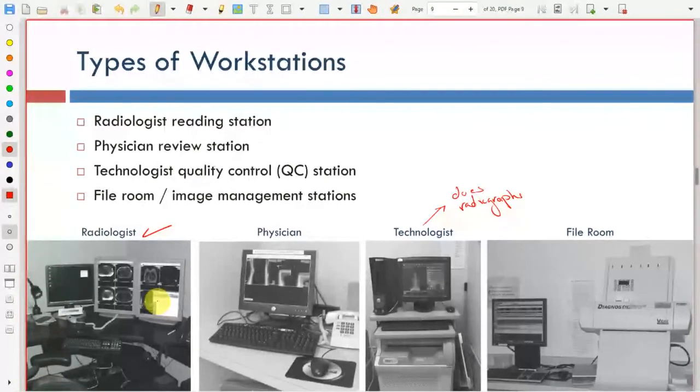Medical grade monitors are extremely high resolution, extremely high brightness. They are very expensive. The color reproduction there is really calibrated so that you don't have differences in colors between different times and different monitors. Basically, it's a much more controlled and much higher quality monitor than the regular monitor that you use on your PC. Here for the PC, you don't really care about the colors, the color calibration. If the red is slightly off red, it doesn't really matter, okay?